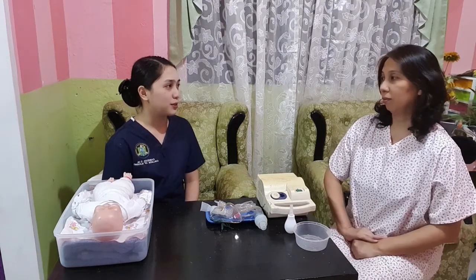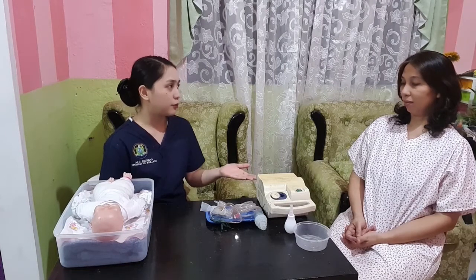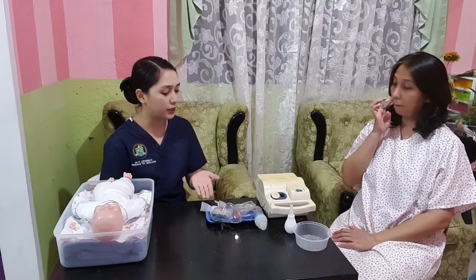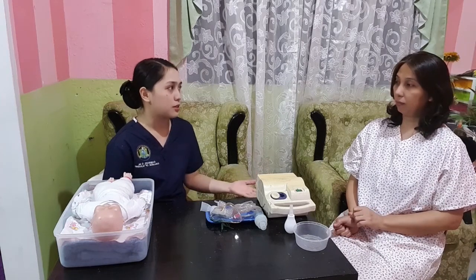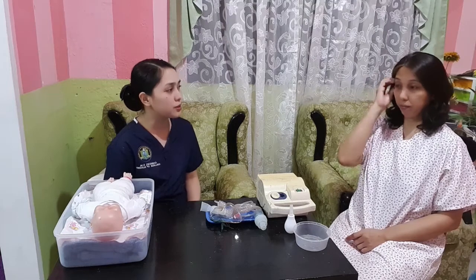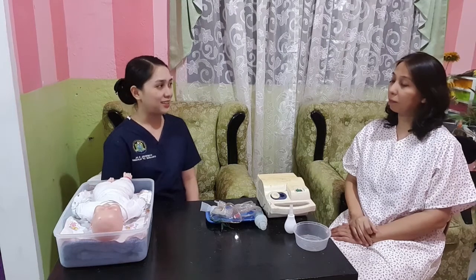So good morning, ma'am. I am Cabiedes and I will be your student nurse for today. So for today, I will be performing nebulization, on which I will be using a medical equipment which is called the nebulizer, on which this will turn liquid medication into mist, so that the medication will be administered directly and quickly into your lungs. So common side effects of this is coughing, sneezing, and or mild wheezing. So if you have any concerns or you feel any discomfort, just tell me right away. Okay, ma'am? Okay, thank you.